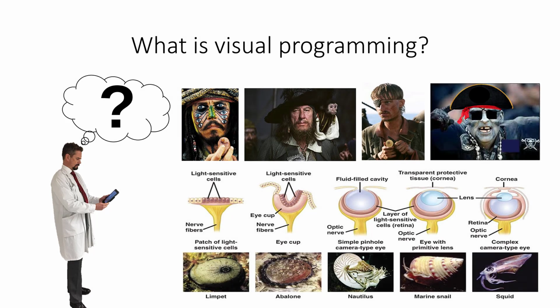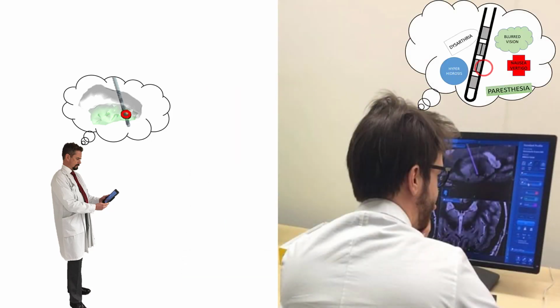And I believe that most of us have always used a visual model when programming. In its most primitive form, we have known where the electrode was intended to be placed, and we have formed an internal image in our mind of the electrode and the local anatomy as a foundation for our programming. At the next level, we have incorporated an image-based verification with CT and MRI demonstrating the location of the electrode and the individual contacts in relation to the local anatomy, hence reducing the level of uncertainty and improving the image in our mind of what we are stimulating.